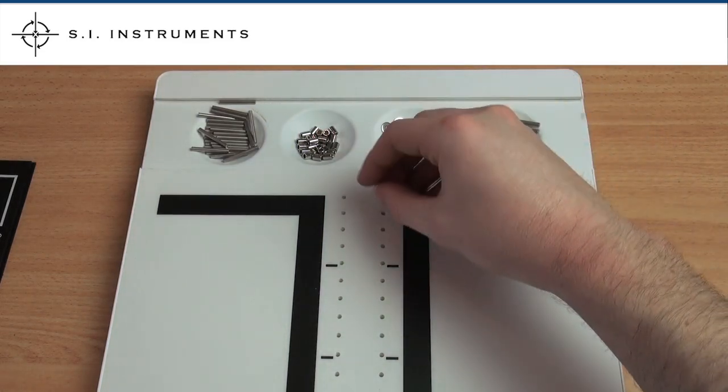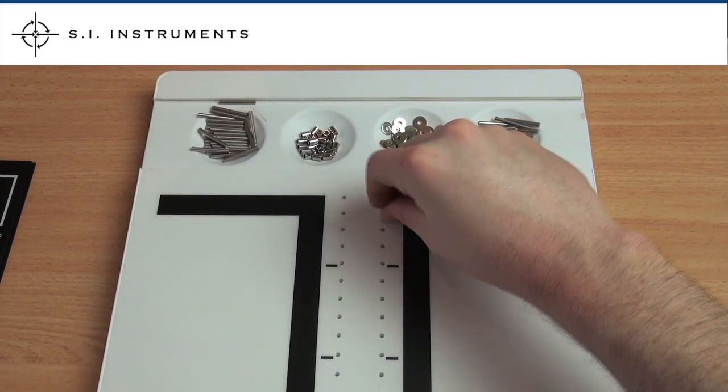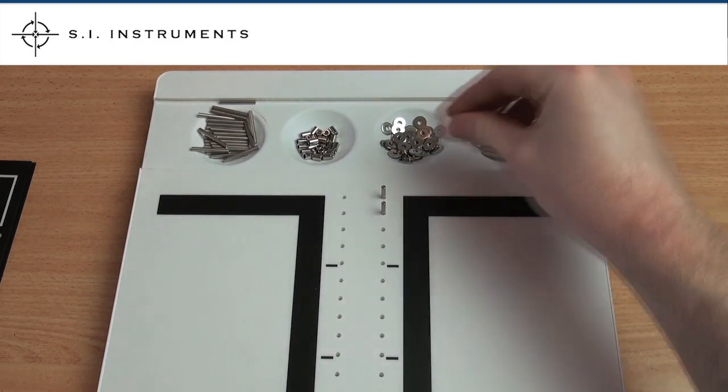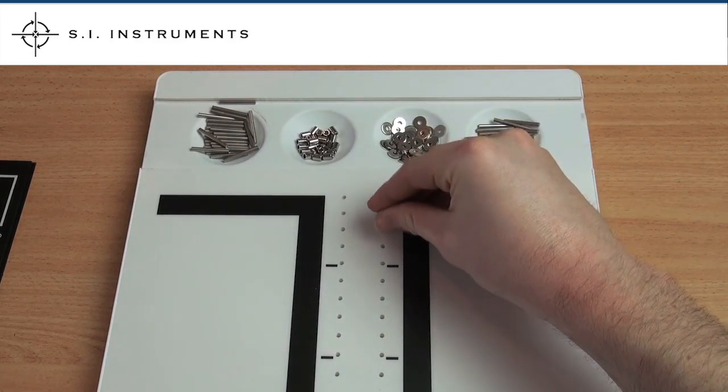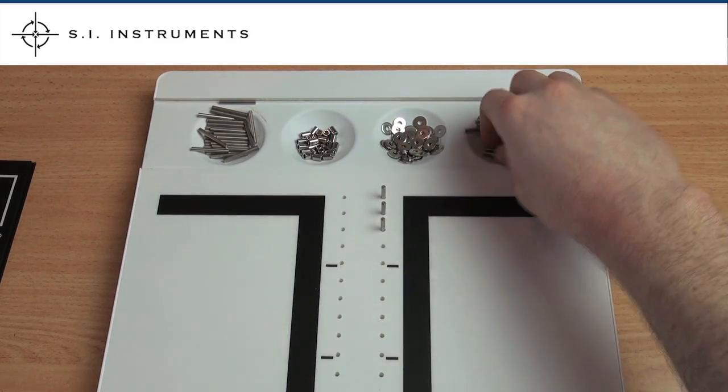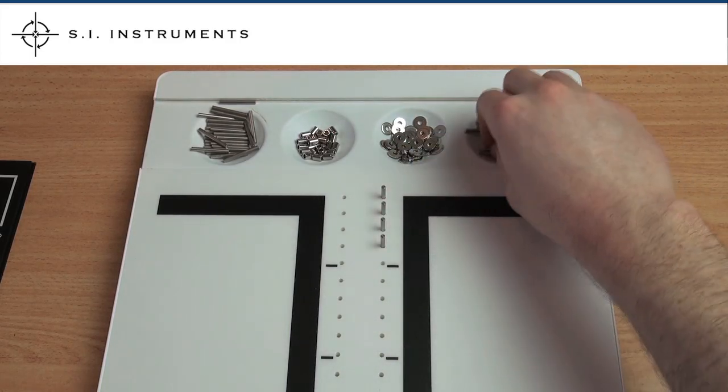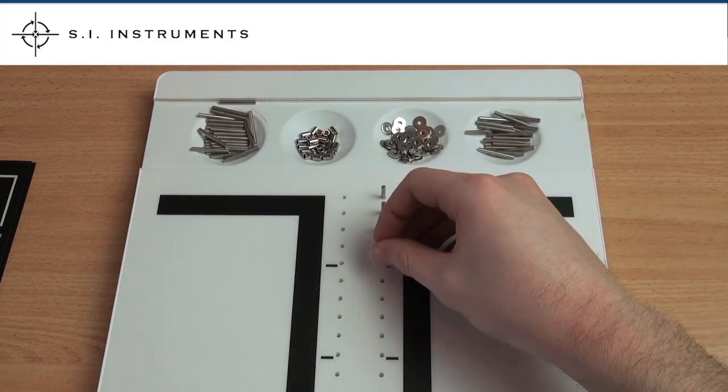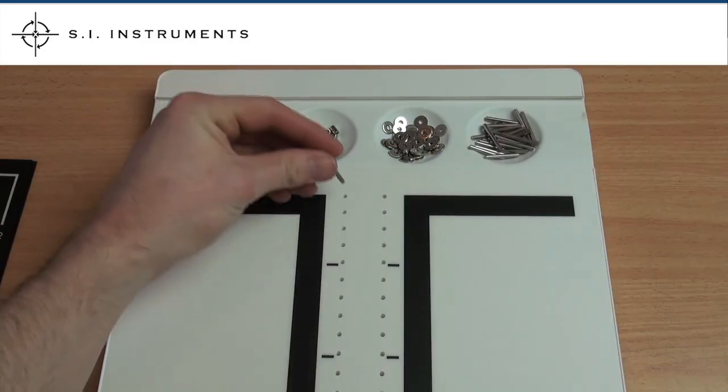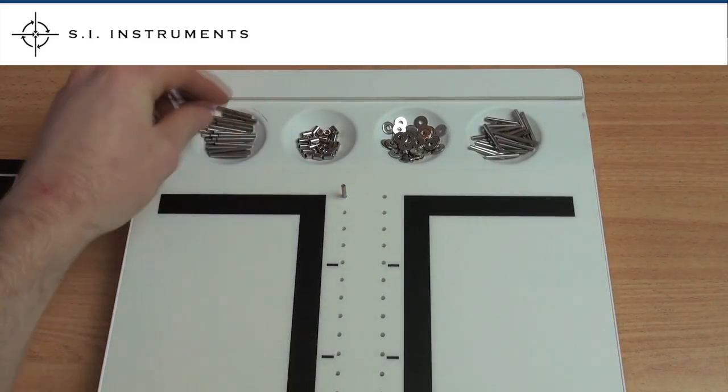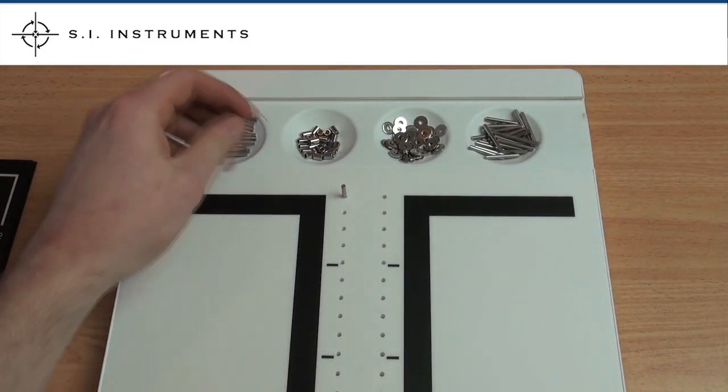To test the right hand, the subject must insert as many pins as possible in the holes, starting at the top of the right hand row. The left hand test uses the left row.